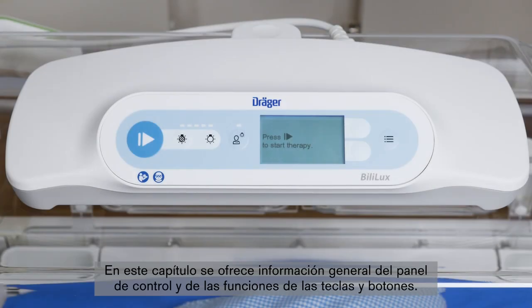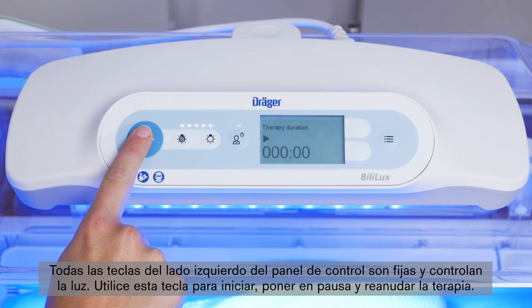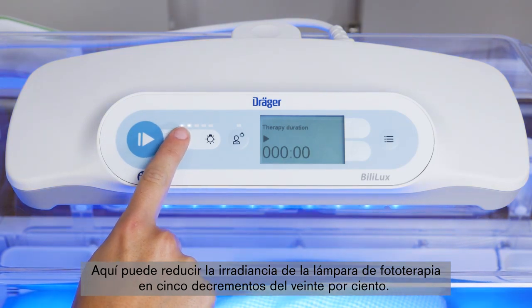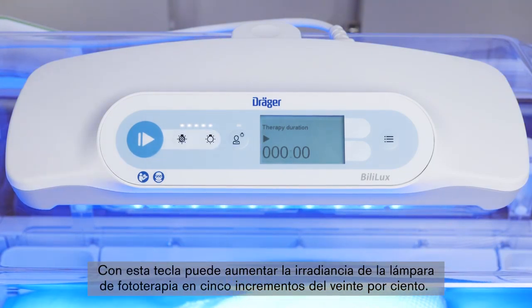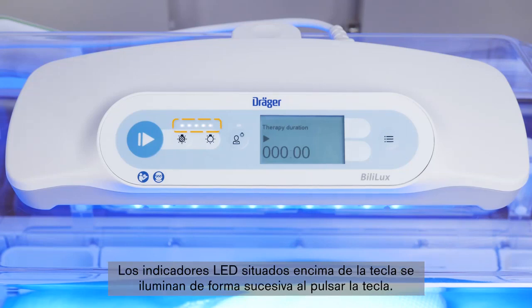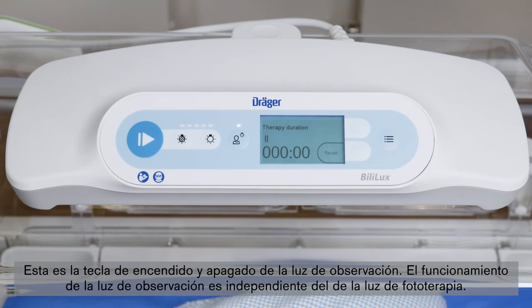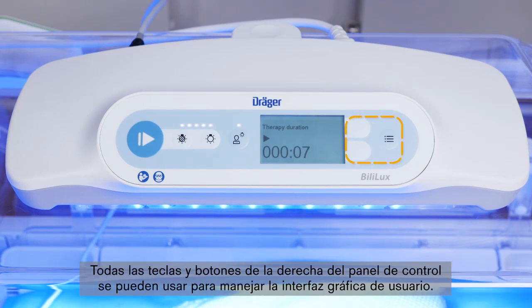This chapter will give you an overview of the control panel and the functionality of the different keys and buttons. All keys on the left side of the control panel are fixed and control the light. Use the start key to start, pause, and resume therapy. You can decrease irradiance in 5 decrements of 20%, or increase irradiance in 5 increments of 20%. The LED indicators above the key illuminate in succession each time the key is pressed, with available settings of 20%, 40%, 60%, 80%, and 100%. This is the on-off key for the observation light, which operates independently of the phototherapy light. All keys and buttons on the right side of the control panel can be used to operate the graphical user interface.